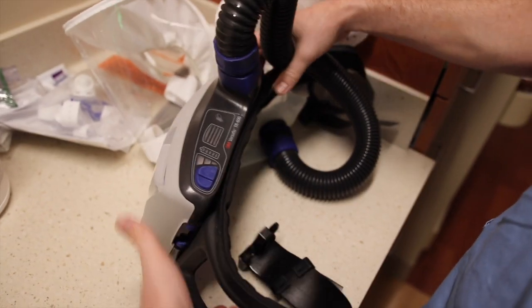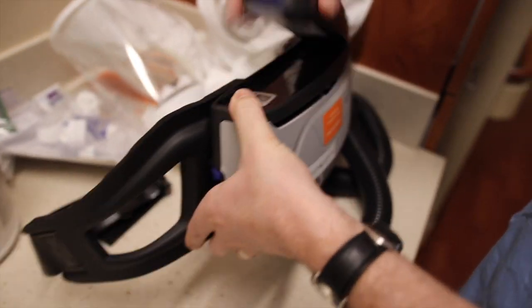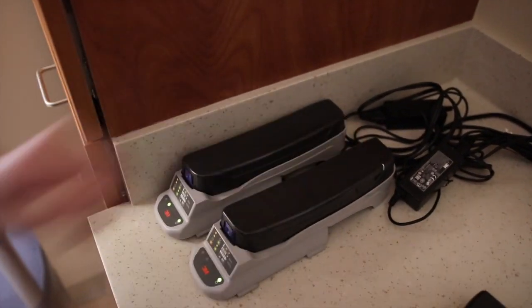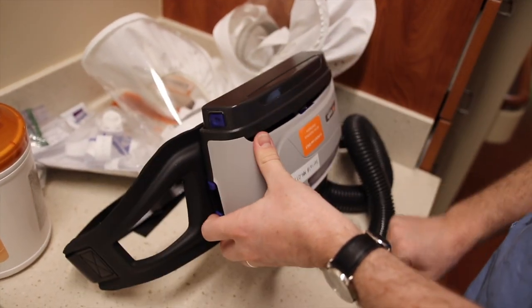If the unit does not power up properly or is showing a low battery, remove the battery by pushing the button on the side and replacing it with a fresh battery from the charging stations located on many floors in the hospital. Replace the battery and power up the unit to ensure it's working properly.